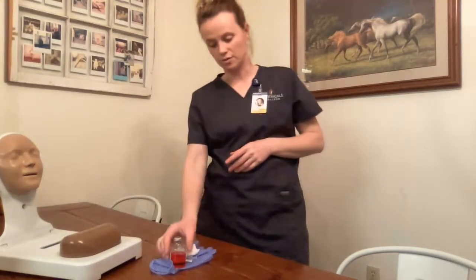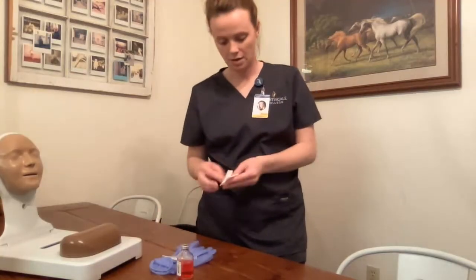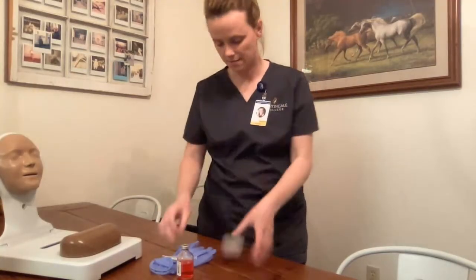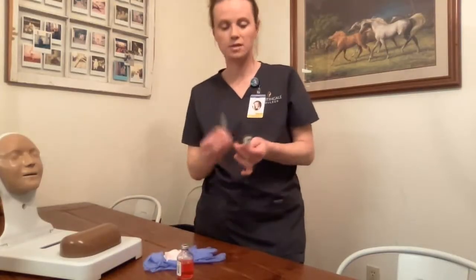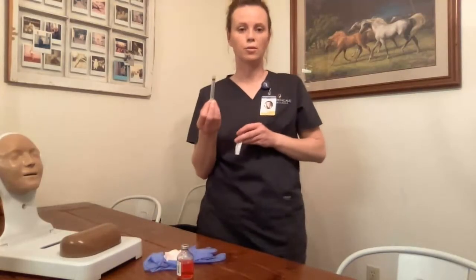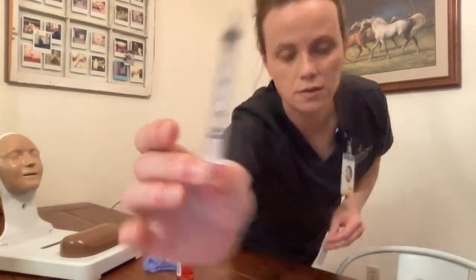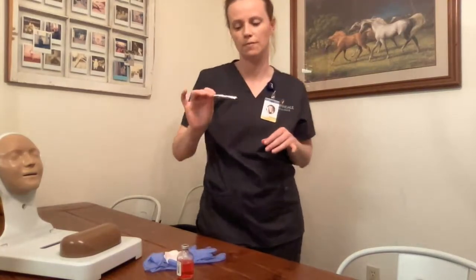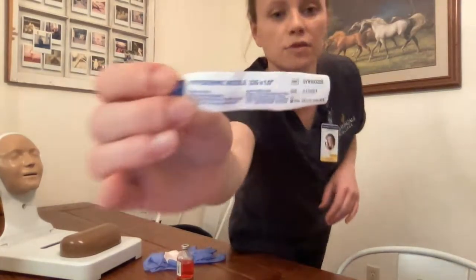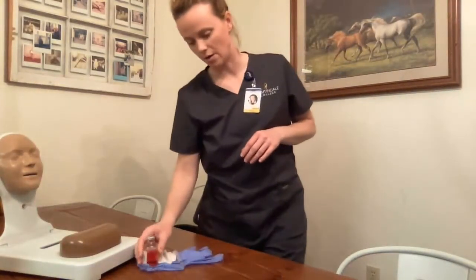To start the skill video off, I'm going to gather my supplies: my medication bottle, two alcohol wipes and a gauze pad, a pair of gloves, and then my syringe and needle. For the skill video, we need a 3 milliliter syringe and then we need either a 22 or 25 gauge 1 to 1.5 inch needle. I have a 22 gauge 1 inch needle. My supplies are ready to go.